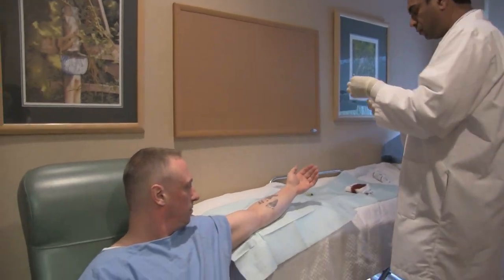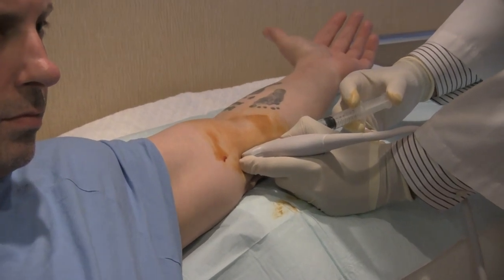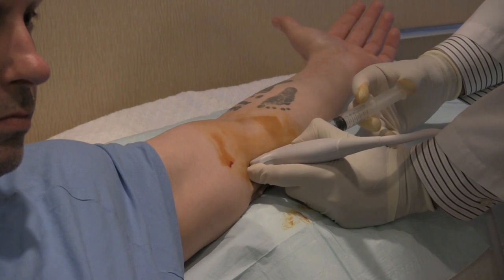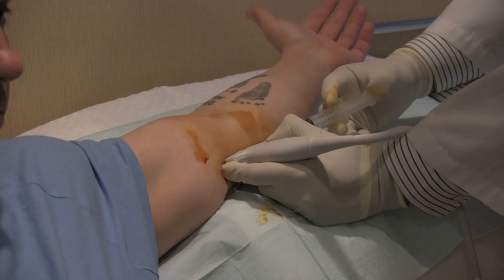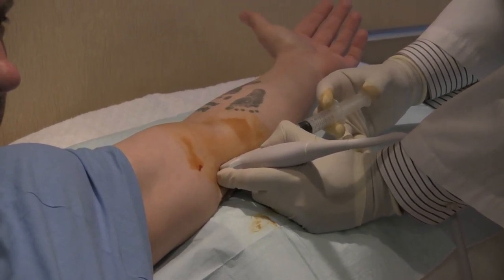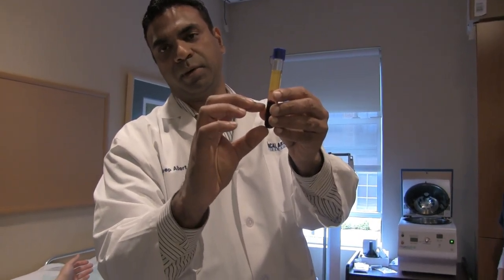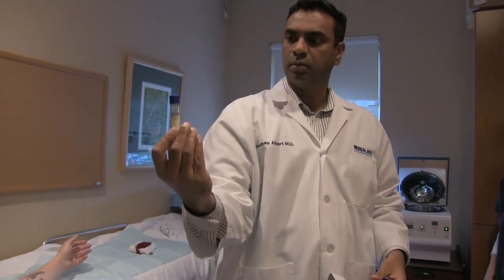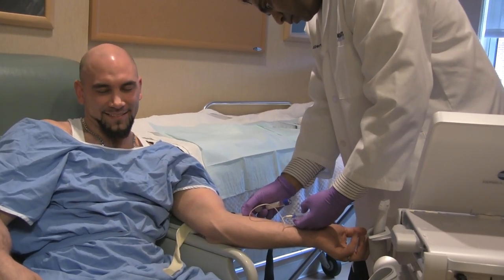Okay, zoom in on it. I'm going to put a little bit of anesthetic in here, okay? Just numb it out. I see the needle. So you can actually see — this is a gel that separates the red blood cells from the platelet-rich plasma. Are you ready? So you injected the clear stuff — above is where the platelets are at? Yes. I got it. So you're just using the platelet-rich plasma.